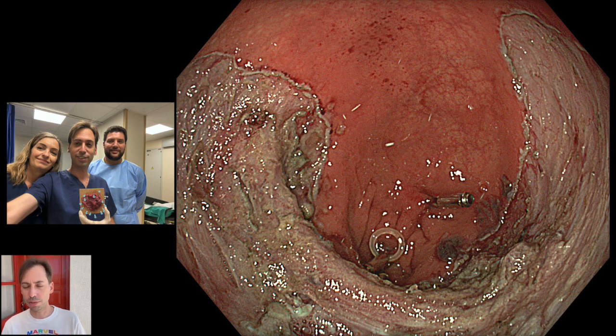This was a 9 centimeter lesion, R0 resection, high-grade dysplasia, 1 night of hospital stay, and the patient had an excellent recovery. Thank you very much for watching.